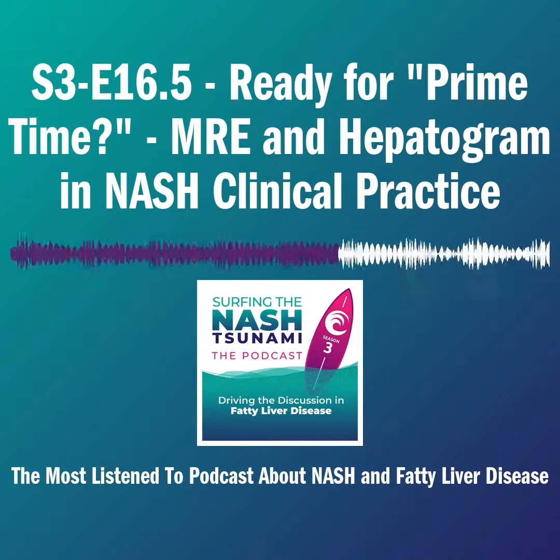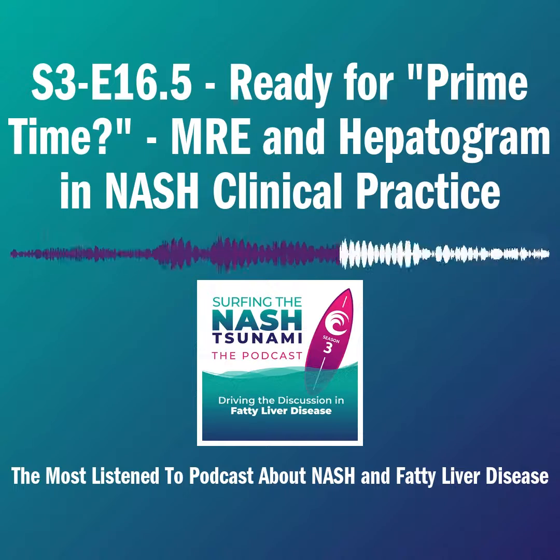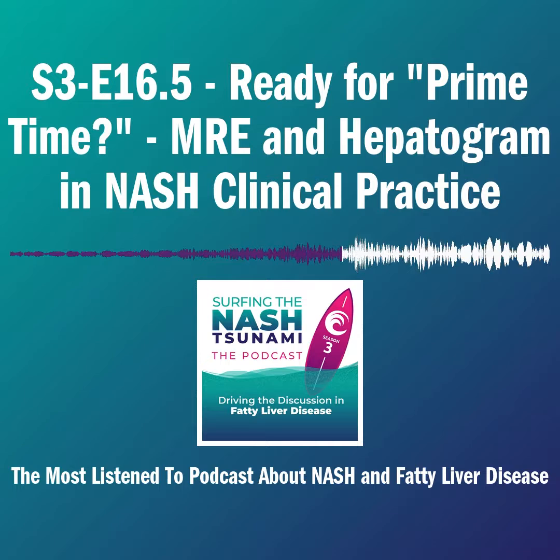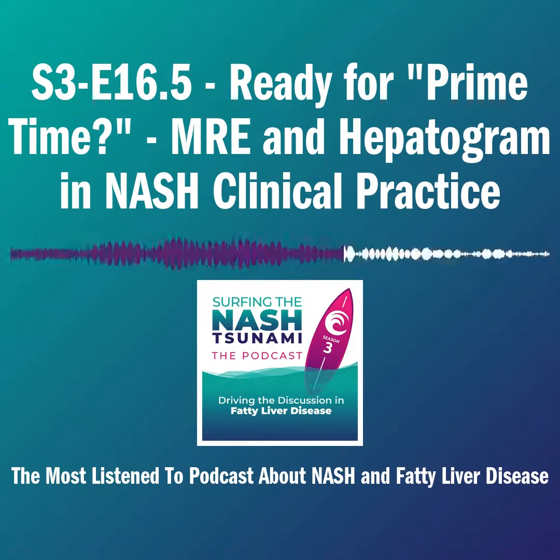Another area that's going to be very exciting and is going to help workflow, accuracy and standardization is artificial intelligence as well. So we have standardized or more automated reporting. And Mazen, that gets to your last point, is that especially with these volumetric imaging methods like MRE, you can segment the whole liver very easily. We're almost there, but I predict within 6 to 12 months, we're going to have automated volume measurements of the liver. And then you could ask those questions and see whether we need to normalize or correct for volume, or just simply look at accurate liver volume as a biomarker in itself, which would be a really easy and interesting one to look at.